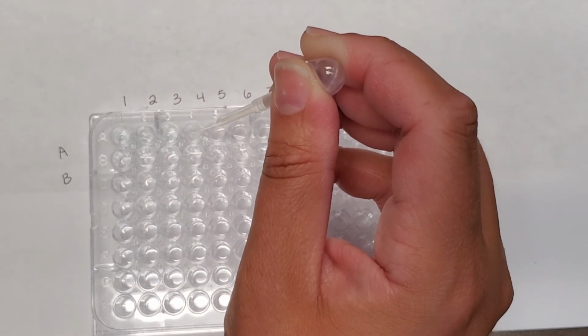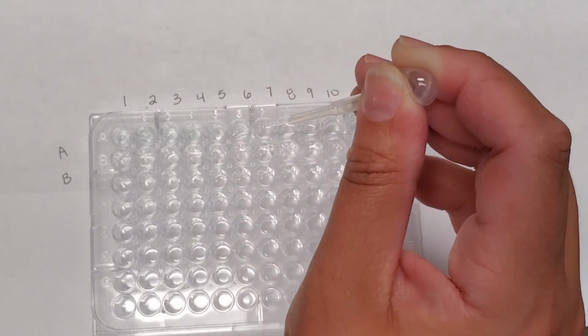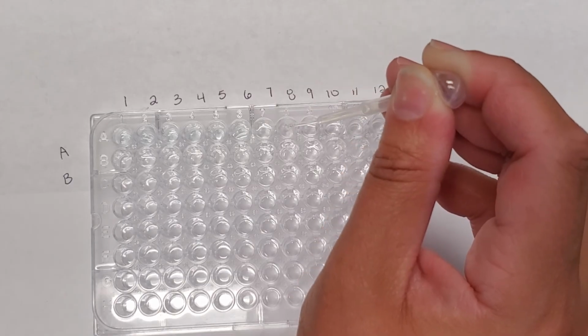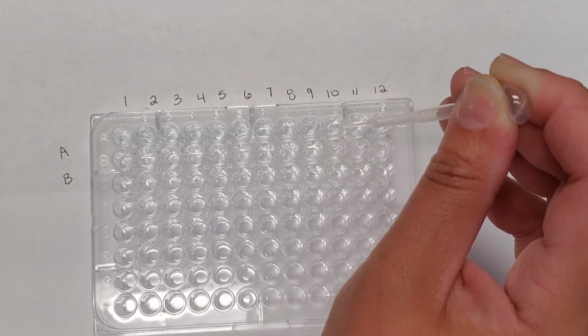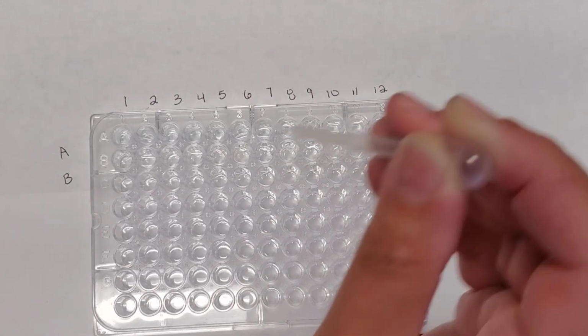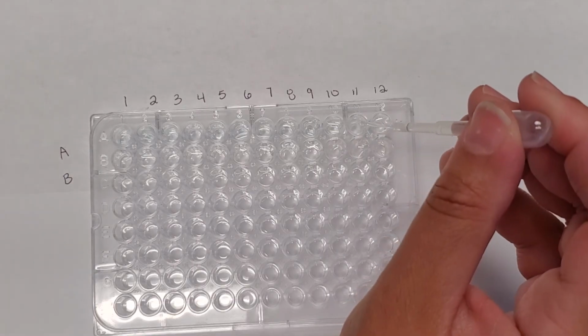And so once again, we're adding 3 drops of the chromogen to each well, because again, we're trying to detect that secondary antibody that we just added in the step before this. If it bound to the antibody present in the patient's serum, this chromogen will detect that and facilitate a color change.